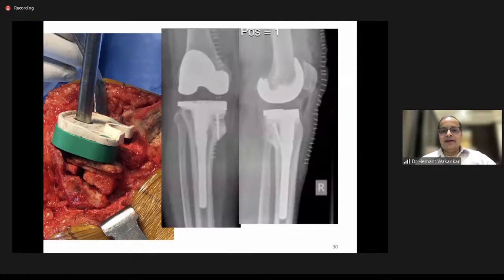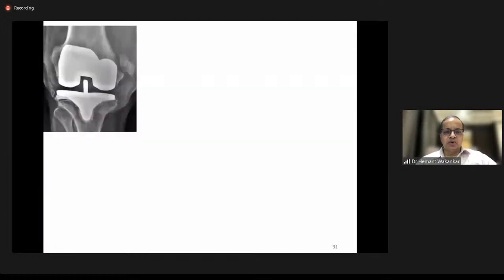And that is the post-operative X-ray of the same patient. As you can see that graft and the augmentation block have been used, and because the stem is added on, the graft is quite secure. And again here, because it was a revision from a uni, I did not need to use any increased constraints in the prosthesis. So just to show you some more examples of the revisions.